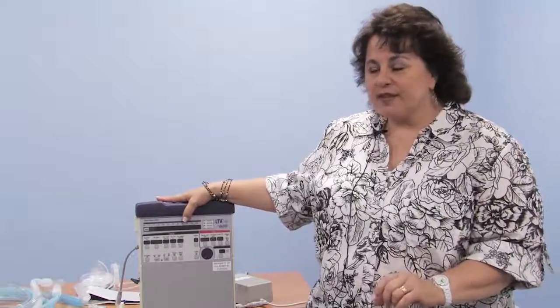That is because that model allows us to hook the wall oxygen that we have at 50 pounds of pressure directly to the ventilator and have a blender so that we can set oxygen in the hospital at a percentage of 21 up to 100%. You can't do that at home because you don't have that type of oxygen delivery at home. At home, you have oxygen that's run by liters per minute out of a tank source or a concentrator source or perhaps a liquid source.